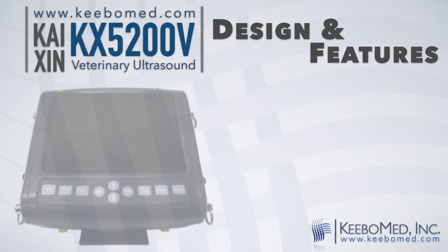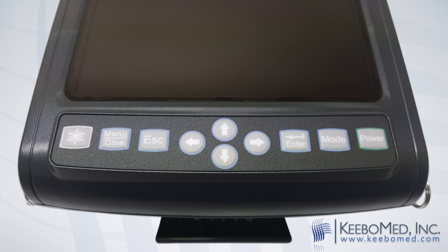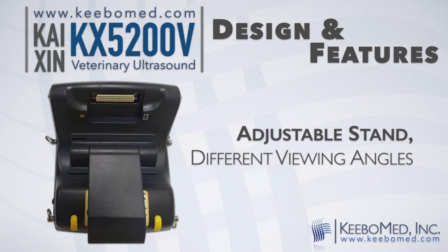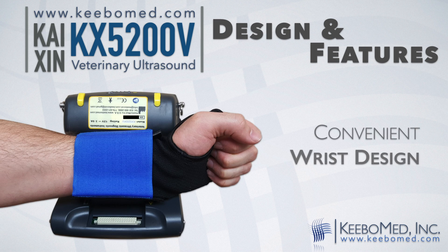It has a simple, easy-to-use keypad. It is small and has a portable design. It can be used on a tabletop using the adjustable stand or it can be conveniently worn on the wrist.